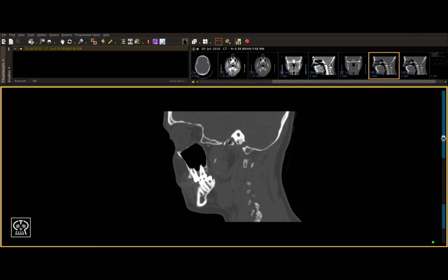That concludes our approach to ZMC fractures. As you can tell, it's a fluid approach that requires knowledge of the anatomy of not only the zygoma, but of many adjacent structures. Now let's go through some examples of fractures and what we can do to assess them in a stepwise manner.